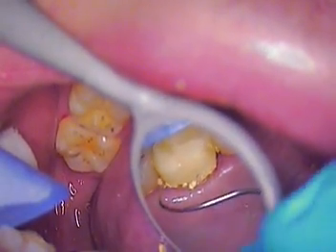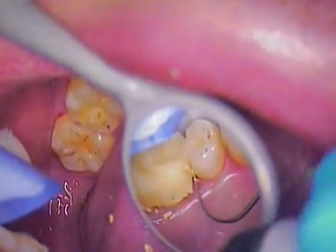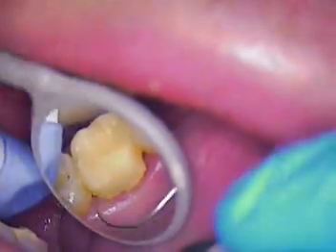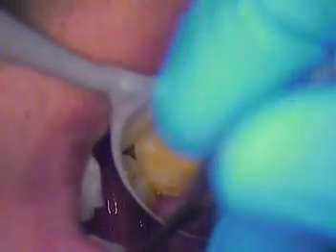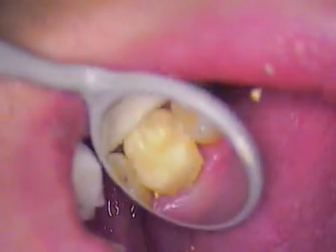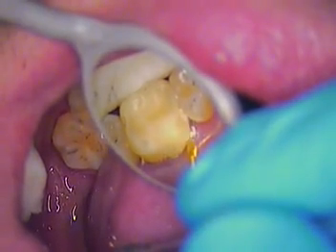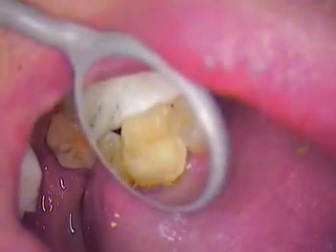See, this is the one I can polish back today. We don't want his tongue to play with that. So I just use a rubber wheel. Or I'll even use a rubber point sometimes and just polish it back. I can go right to the scaler after I clean a little bit more with this. Buccal and lingually. And I have a nice scaler here. Right. But that's it. I'll just polish this one spot a little bit. Maybe get it with this. There we go. Bingo. That's it.